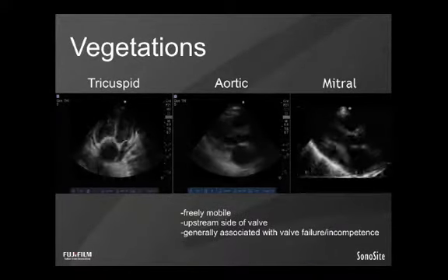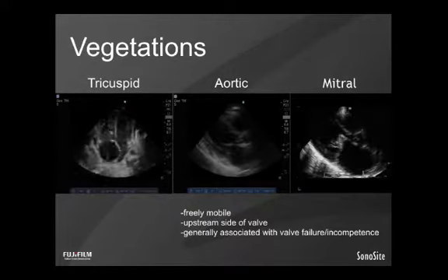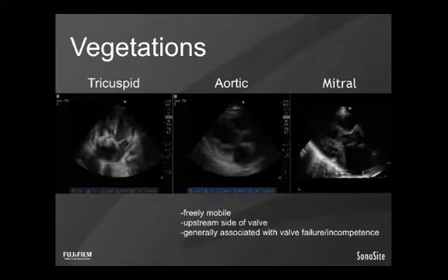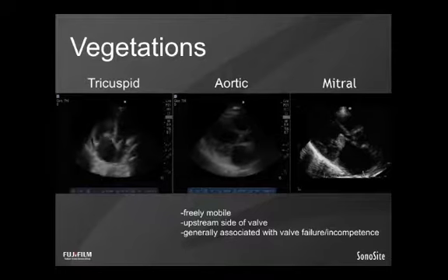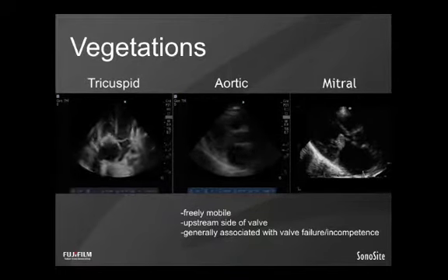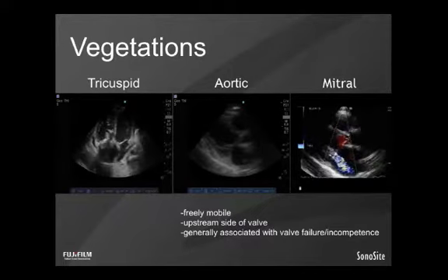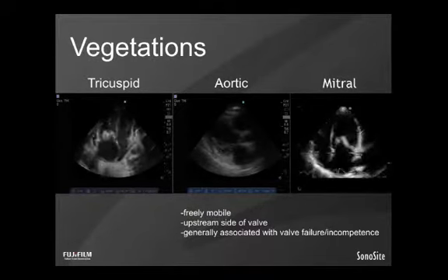We've commented a little bit earlier on endocarditis, and I want to mention that while endocarditis is undoubtedly an advanced concept to rule out, it will occur frequently for the point of care user who does enough echo that you will stumble across meaningful valvular vegetations. And for the point of care user, a vague understanding of what you should be looking for is important.